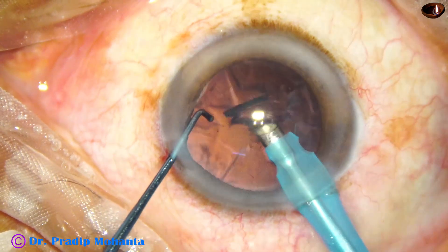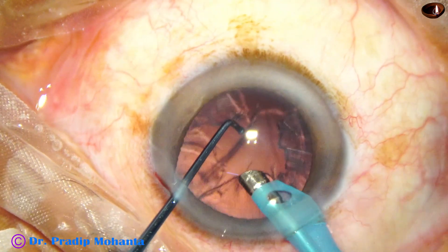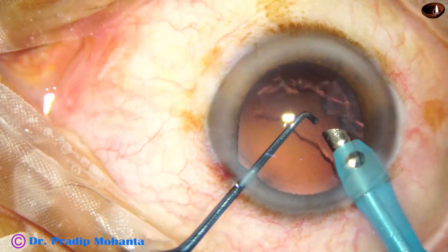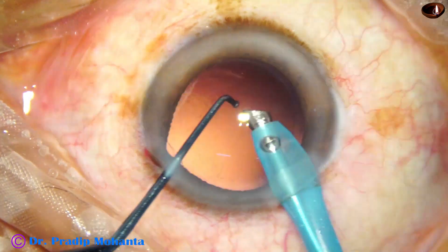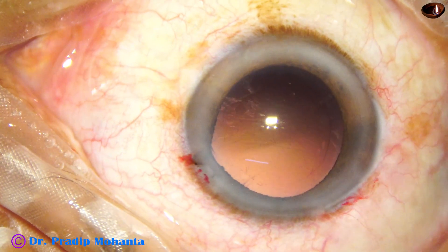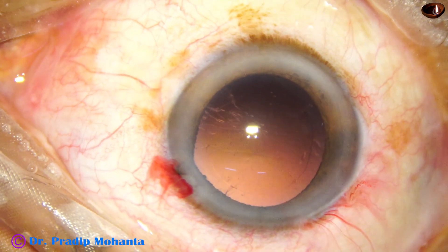I was inspired by my friend Dr. Neto to remove the cortex with the handpiece itself. Initially I had two or three posterior capsule ruptures, then I learned how to do it. But this is up to you whether you try this or not — you have to take your own risk.